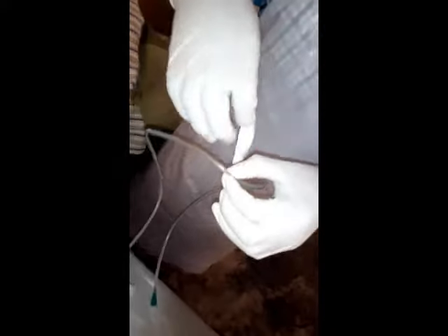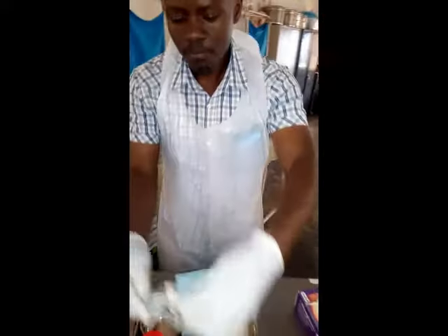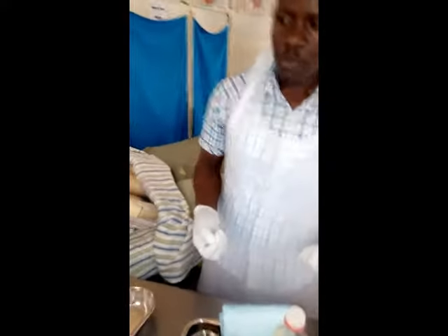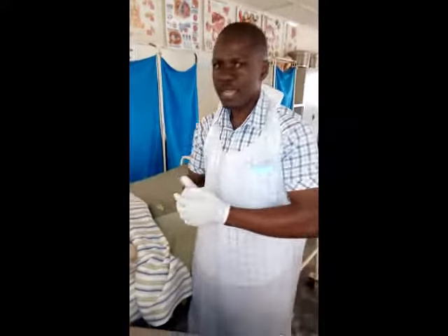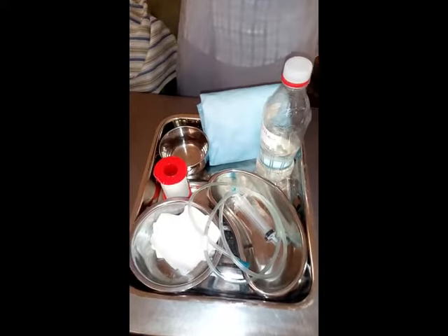You get a marker and put it there. You strap it there so that you don't have to memorize where your mark is. No need to memorize, so just put it there. Even if you put this tube back, you'll be able to get the tube instead of memorizing where you marked or which parts you measured. It's better to just mark with a tape so that when getting it, you can just get it like that.